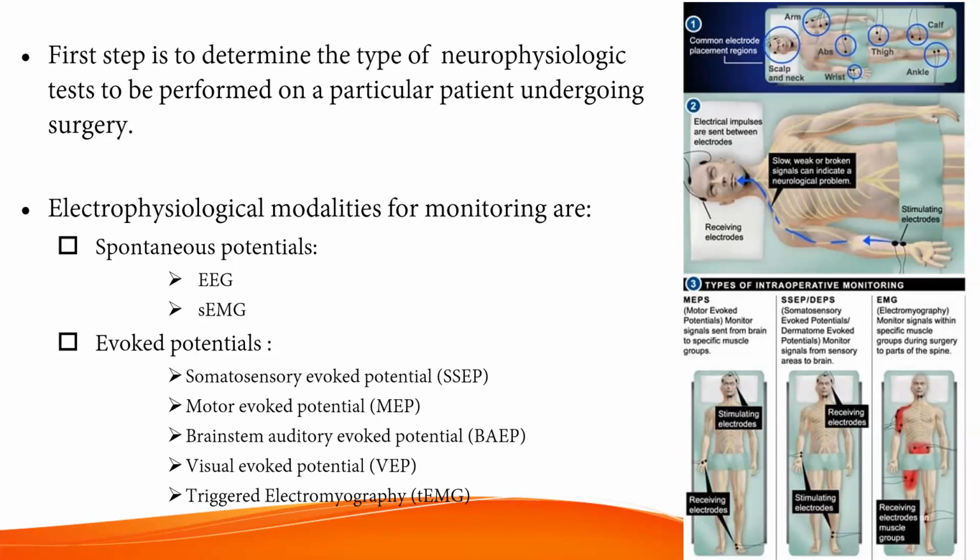Let me explain a little. In MEPs, we stimulate at the scalp, and the resulting response is collected distally in the muscles. Whereas in EMG, the particular muscles are connected and recorded throughout the surgery.